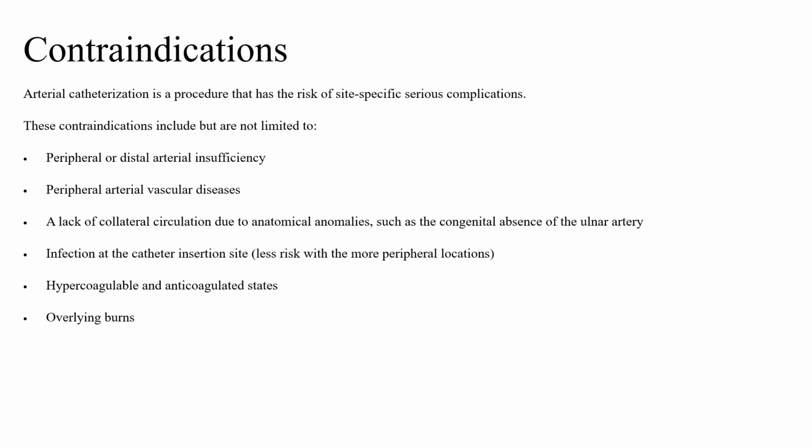So we talked about indications for an arterial line. Let's look at some contraindications. Again, we know that arterial line placement has risks and very site-specific serious complications. While this is not necessarily an all-inclusive list, these are some of your really big contraindications.